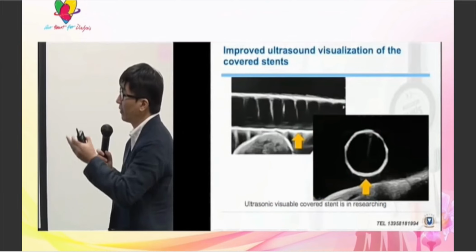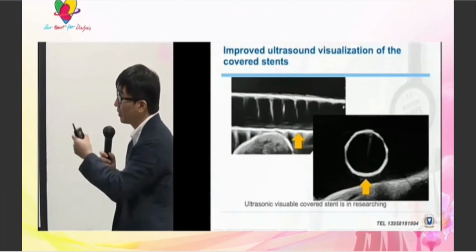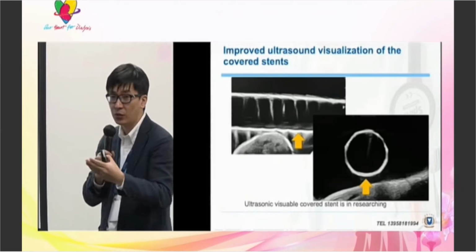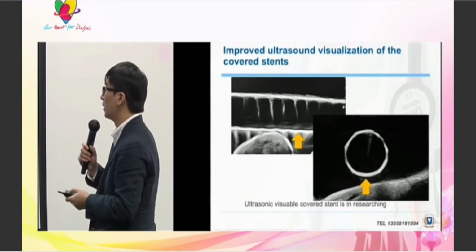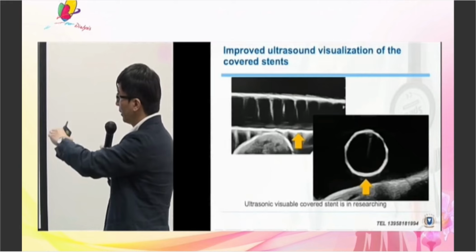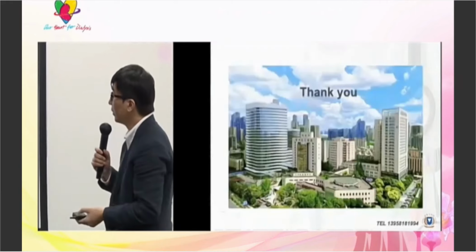The covered stent. This is a sample, not a product. This sample is being developed with hospitals and another company coordinating to make this stent. As you can see, the superior and inferior walls of the stent are visible. So that's all. Thank you.